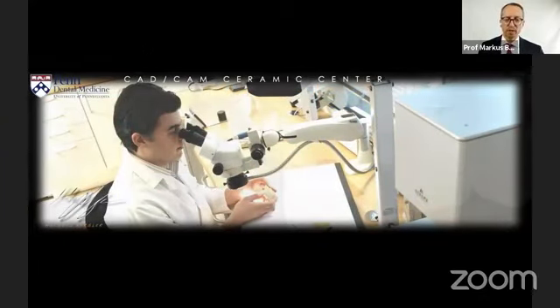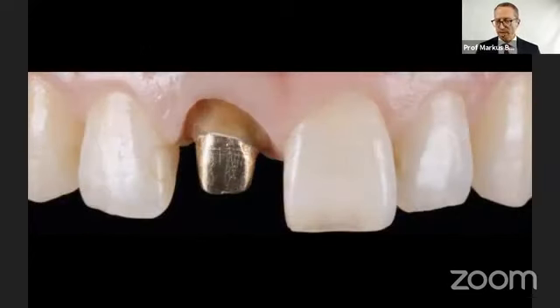As I mentioned, we have focused on ceramics quite a bit over the years, also in CAD-CAM technologies. And I still believe that in some instances, you have to mimic a very delicate situation, as you can see here, with natural teeth that have very intrinsic properties when it comes to aesthetics. Plus, I have to cover and block out that cast gold post.